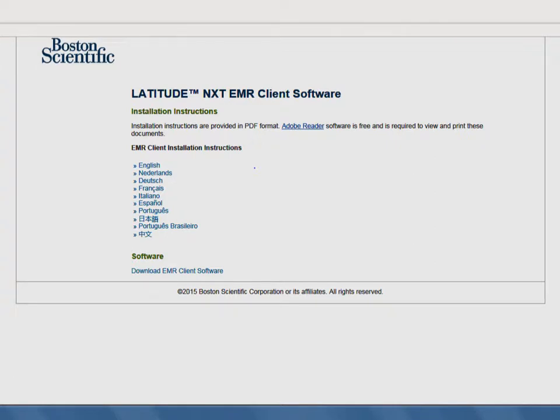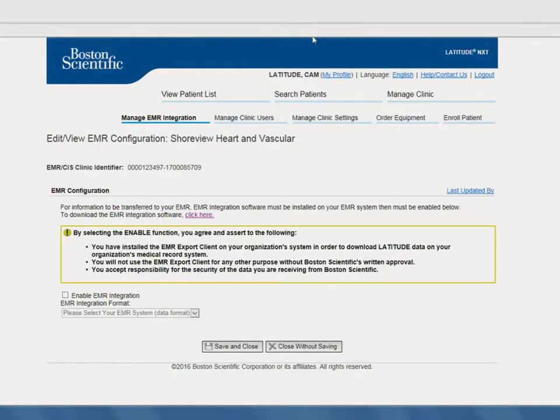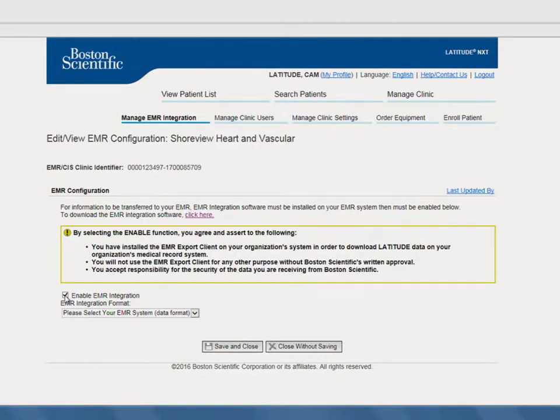We recommend you complete these steps before enabling the EMR integration. Once you've completed the EMR client installation process, on the Latitude Next website you should now have your Clinic Account Manager proceed to check the box labeled Enable EMR Integration.